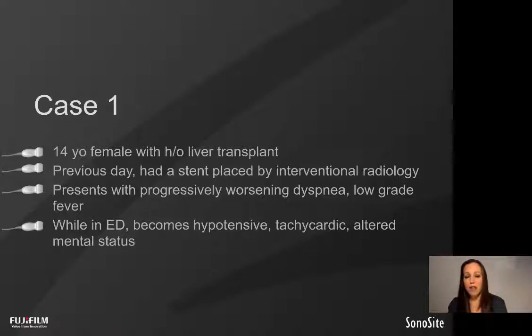And obviously, when I saw this patient, I was concerned. Now, admittedly, this was before I knew about the RUSH protocol, so I performed the ultrasounds completely out of order and finally discovered the reason why she was having acute difficulty breathing. But it's much easier if we follow this protocol of RUSH. Now, we're going to start off with the heart.